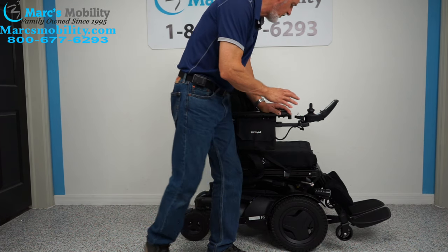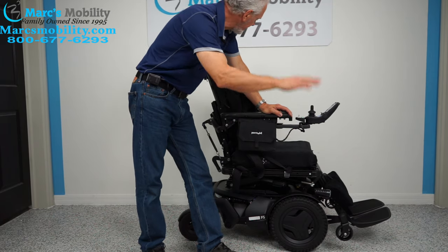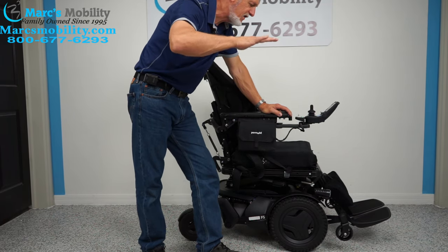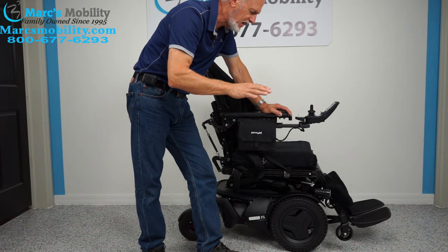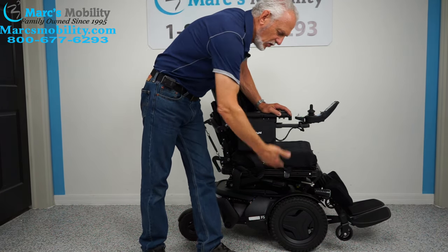To recap the seven functions: the standing feature, electric tilt, electric recline, 14-inch seat lift, electric anterior tilt, and the feet going up and down.